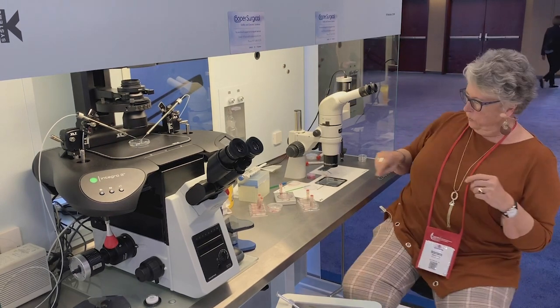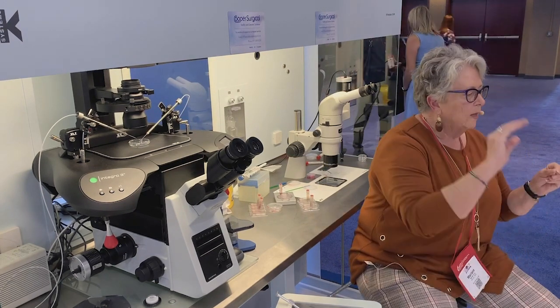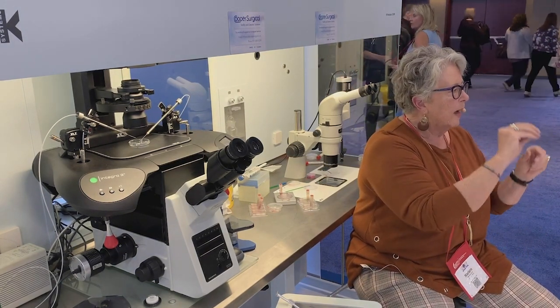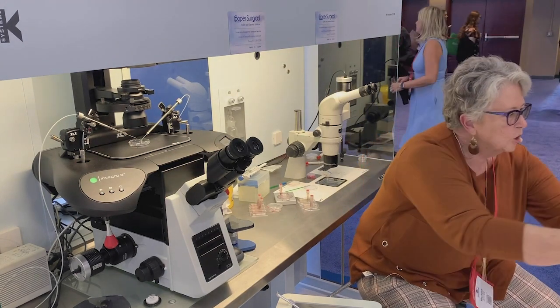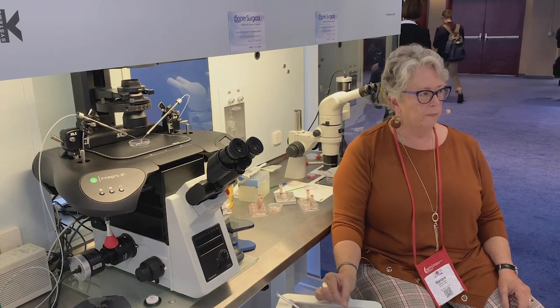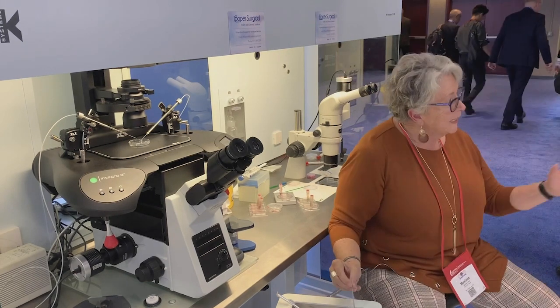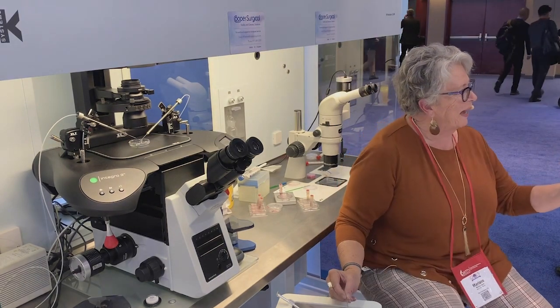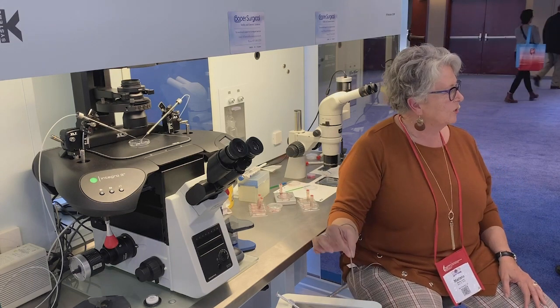So then, you're going to put it in without a cap. Now, this has got the curve side up. I want to put it in curve side that way, and I'm going to push it through my vitrification solution. So I put it in and push it back and around. I've seen people put it in and go like that, which I think is a little aggressive. I don't think you need to do that to accomplish the job. All you really need to do is stick it in.